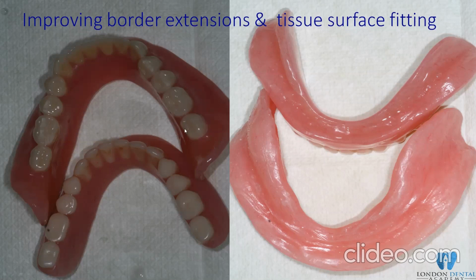On the lower arch, this is one of my trainees' dentures. The only thing which I wouldn't do in such cases is the sevens. I never set up the sevens in upper or lower dentures. I always keep it shortened to the 6, and sometimes to the 5, if the patients have very limited mouth opening, cancer patients, or the patient is quite old, frail, or even implant, bridge, or overdenture. So I would say 80 to 90% of the cases to the 6, and 10% to the 5. It depends on the case.